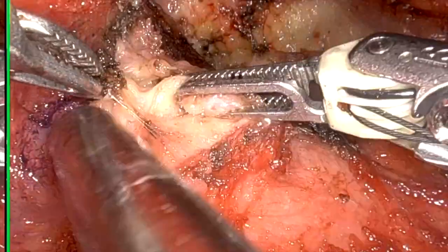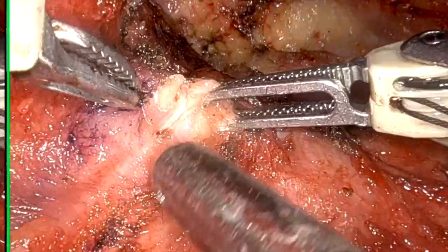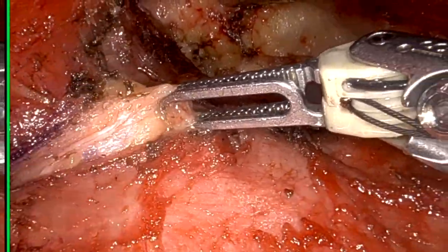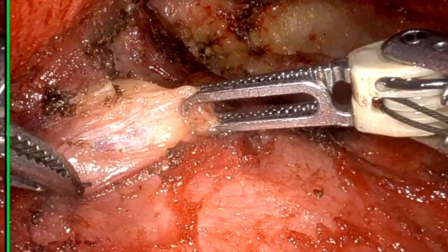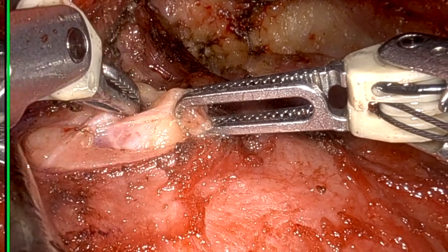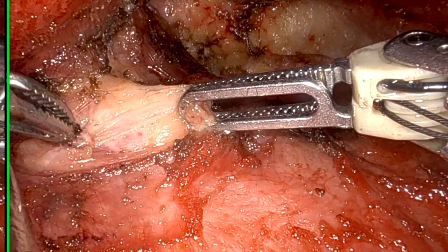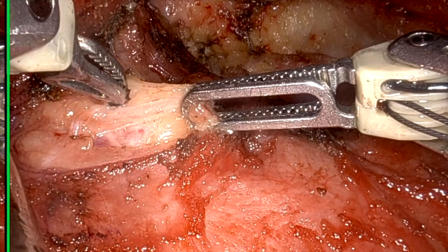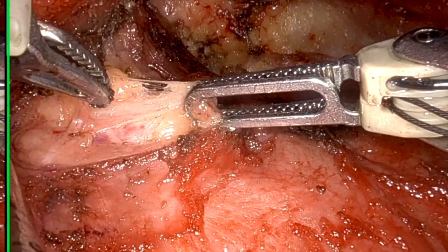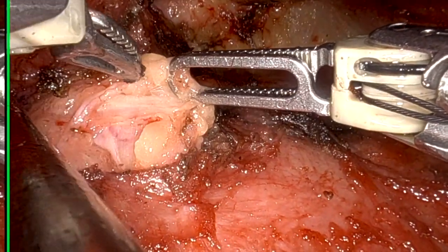There it is. Can you see? Marginal mandibular nerve. Just above a vessel. I will dissect it anteriorly. Very careful dissection in this area, because the marginal is a very sensitive nerve.